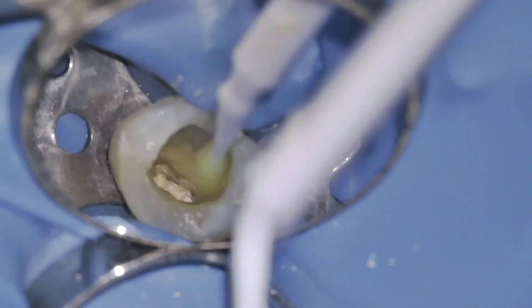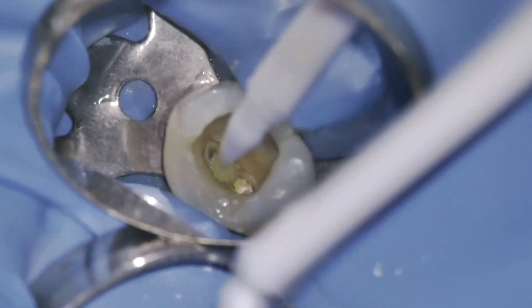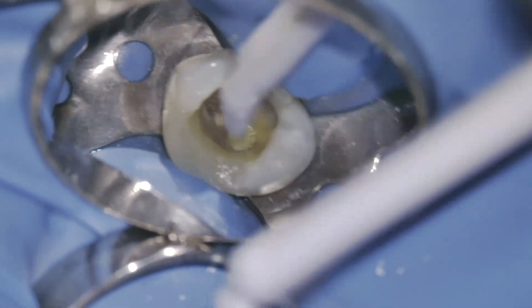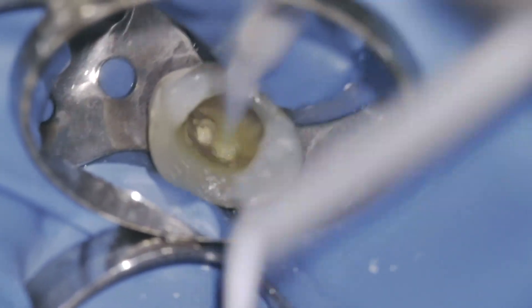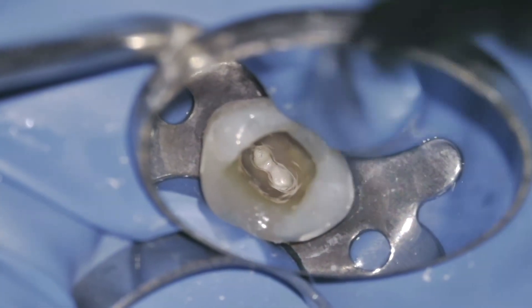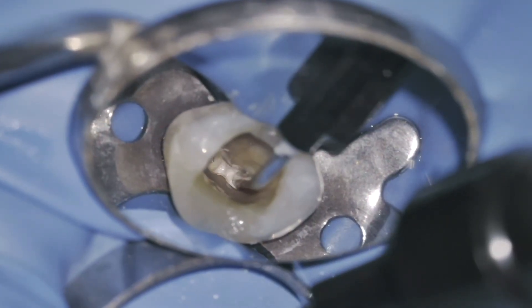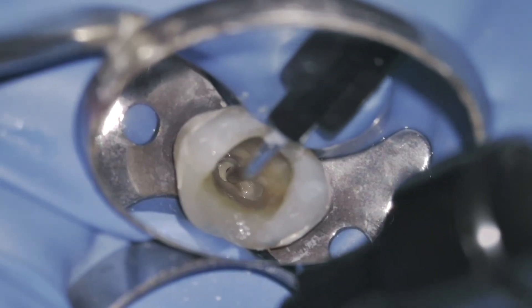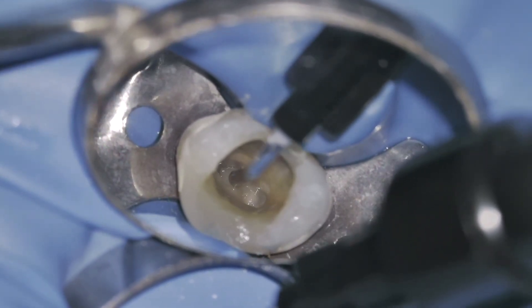Once the obturation is complete, I sealed the access cavity with a composite restoration. This step ensures a strong and durable coronal seal to protect the tooth from re-infection and maintain its structural integrity. A proper coronal seal is just as important as the obturation to ensure long-term success of the endodontic treatment.